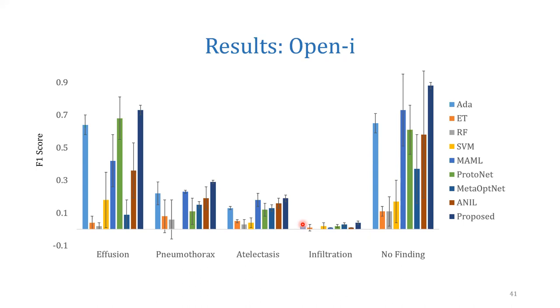Another quick question here. So the chest X-ray images might be associated with multiple labels, multiple diseases. Are you predicting multi-labels here? Right. For these methods, we cannot predict multiple labels. We predict only one label. And our consideration is that if that particular predicted label matches with one of the ground truth labels of the query image, we consider that as a true positive detection. Okay, I see. So that is a drawback of the proposed method. We don't use this method for predicting multiple labels. Okay.